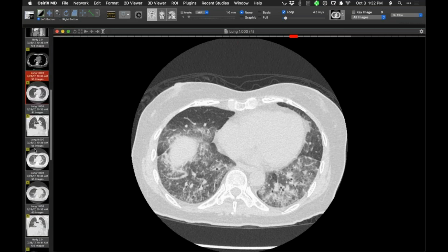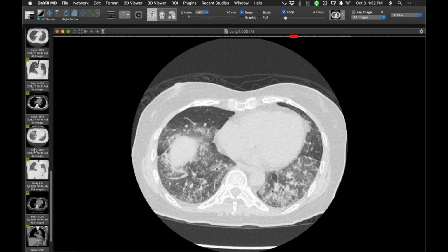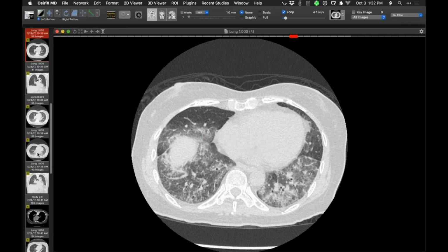So that is 17. Let's go forward to, so this one is July of 17.